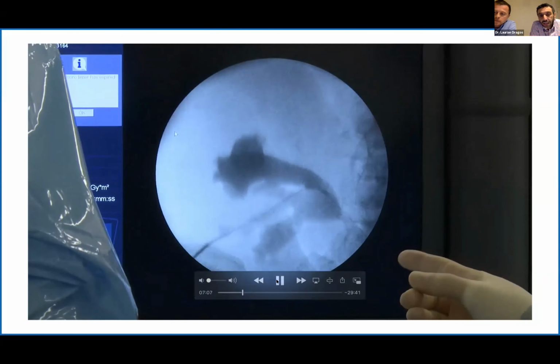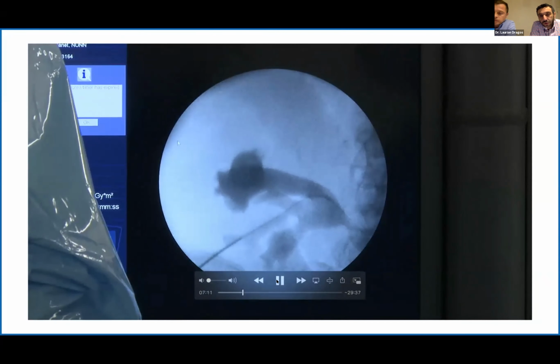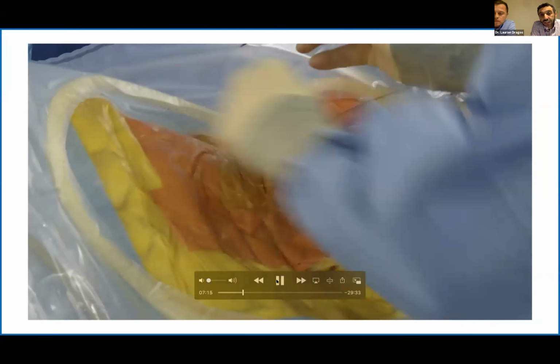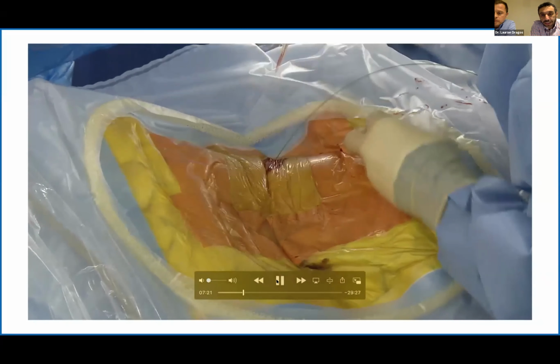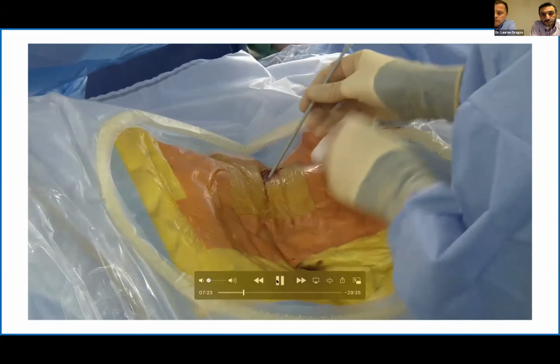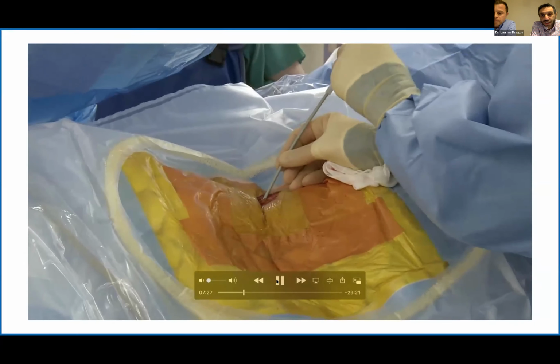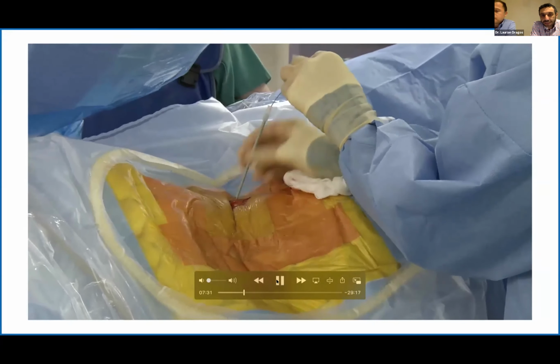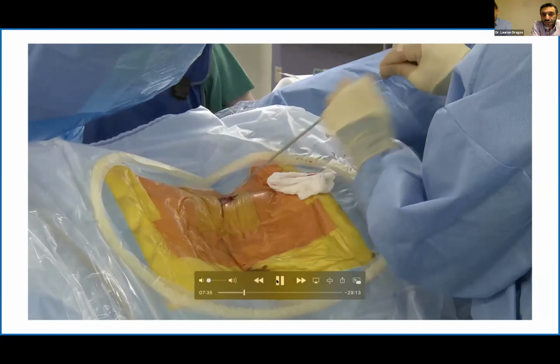You can see our radiologist and the Winterbottom is trying to dilate the tract, has already got the wiring, with a significant degree of movement in terms of the kidney. We always use 2 wires, one wire safety and one for access. Again, you can see later on during the procedure that you have to adapt and change things, and actually having 2 wires there was impeding our progress, and we've had to change tack.